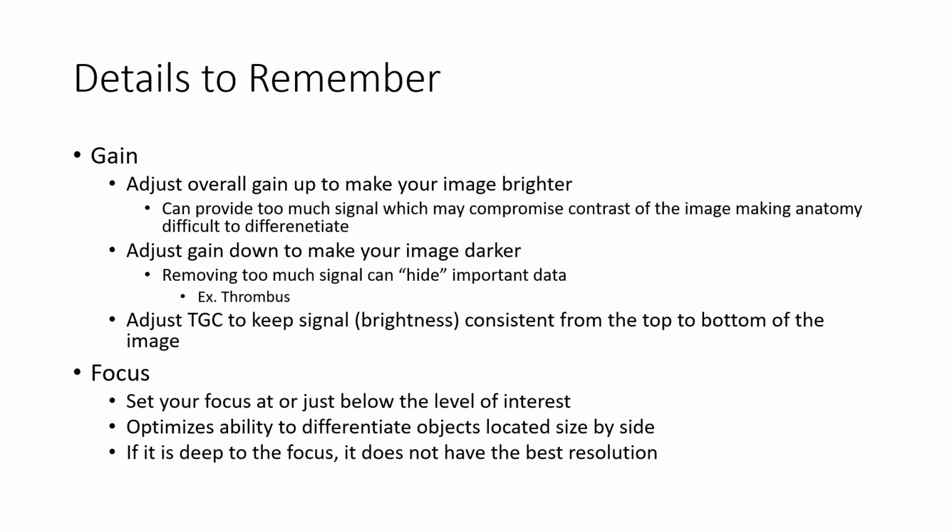That would really just be covering up the pathology rather than providing the accurate information. A gallbladder is another place where you can get too low of gain, which could cover up something like sludge.